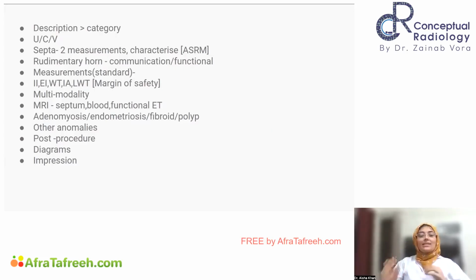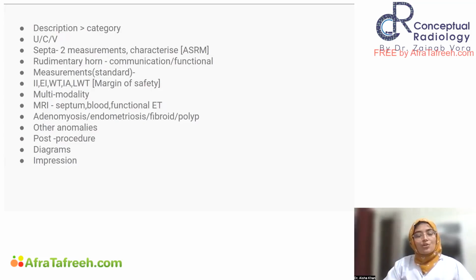Septa का always give at least two measurements, the length and the width, and characterize this. Is it fibrous? Is it muscular or fibromuscular? Rudimentary horn का always look if there is a communication or not, and is it functional or not. In these things, a lot of times MRI helps more. Okay, in septa and in cases of rudimentary horn.